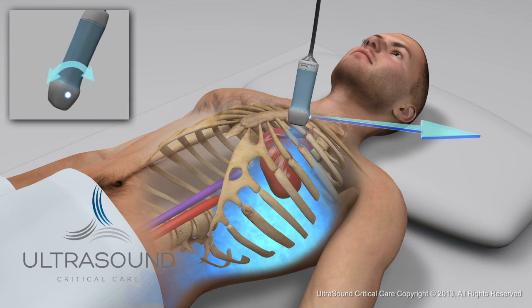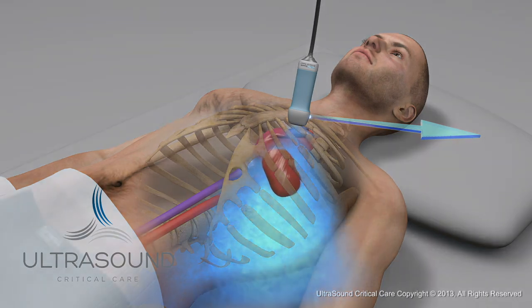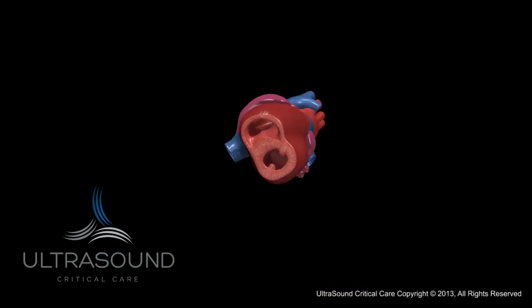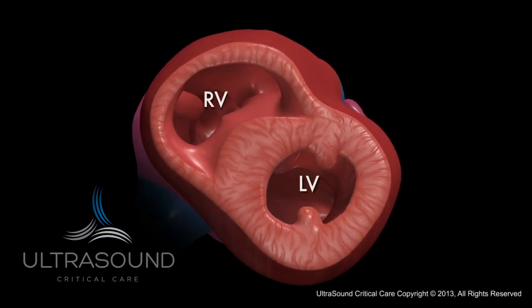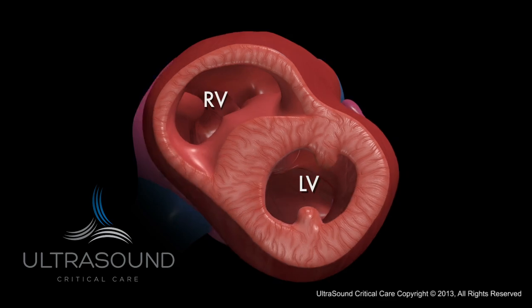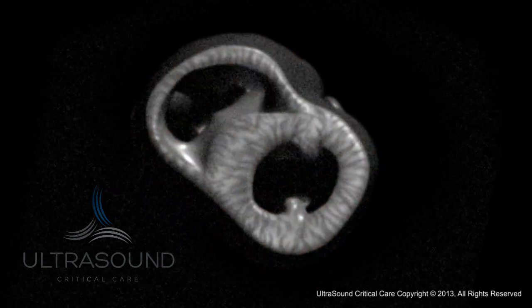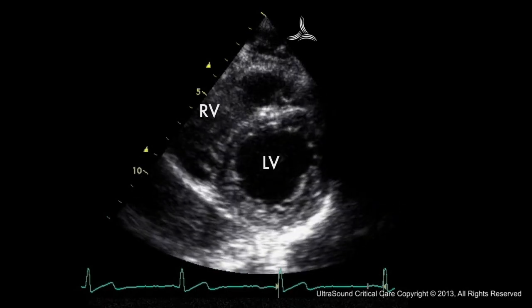Tilt and rock your probe to obtain the best view. Note we are visualizing the papillary muscle view of the left ventricle. The chambers are also labeled for each structure.